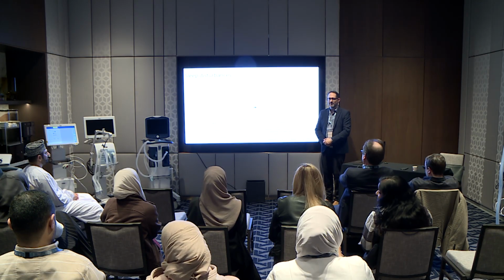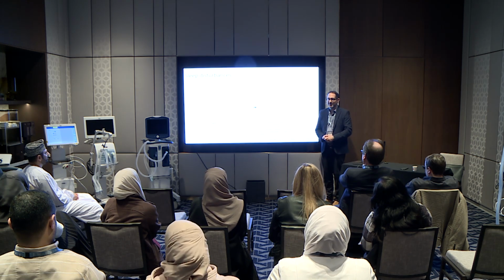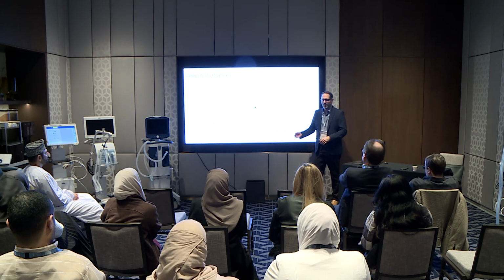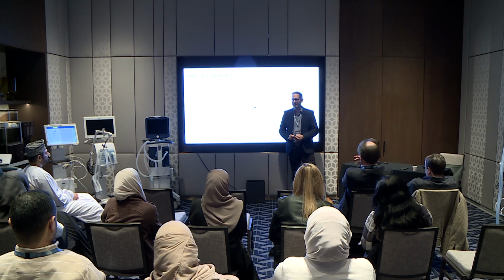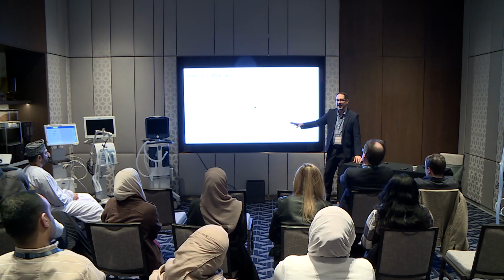Many times. So this is why I joked earlier about SIMV being the nuisance mode. Many RTs will just put them on SIMV at a rate of 10 or something. You should wean the patient. What's happening is the minute they fall asleep, you're blowing off too much CO2 and they have a central sleep apnea. Okay? So we're maybe going to talk about PAV and NAVA later.